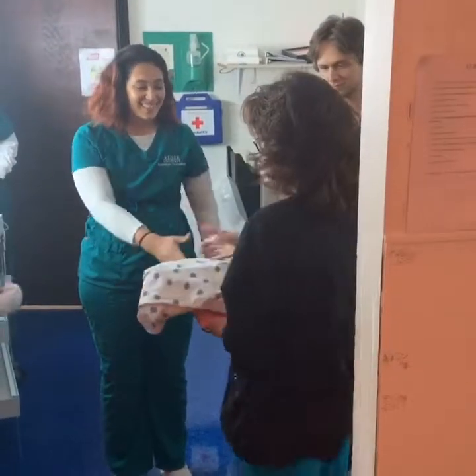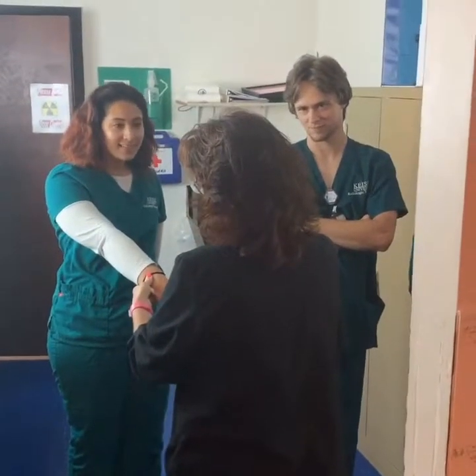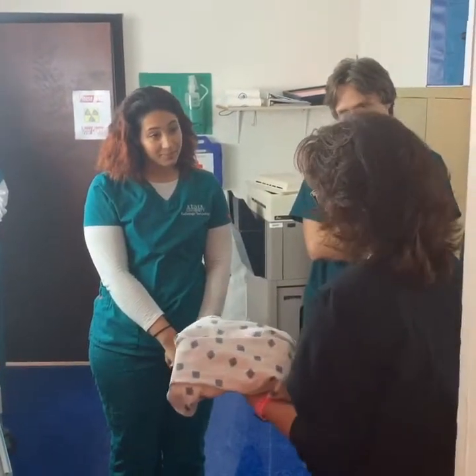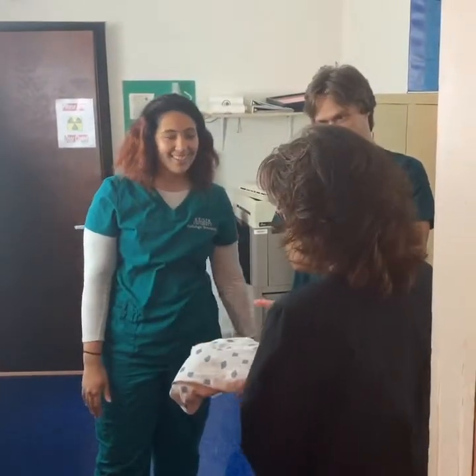Destiny? Yes. Hi, I'm Lisa. I'll be your tech today. Can you confirm your last name and date of birth? Marino 8699. Okay. And I see you're here today for some pictures of your femur. Yes. Is it your right one? Yes. Okay. What we're going to do before we get started with that, I'm going to have you change.